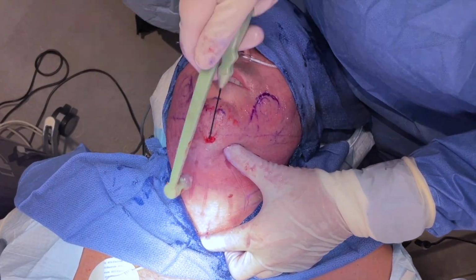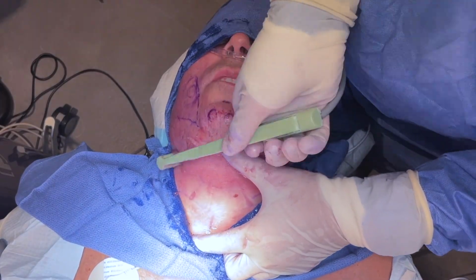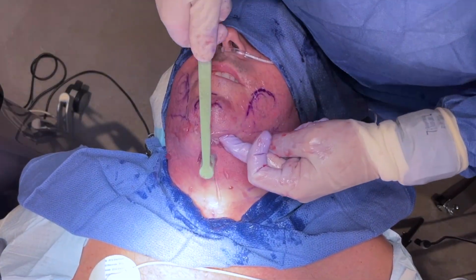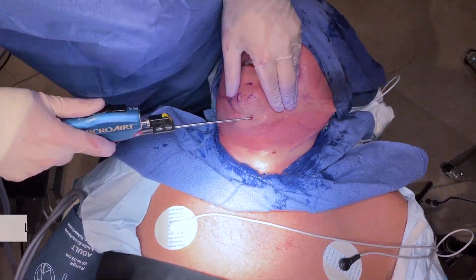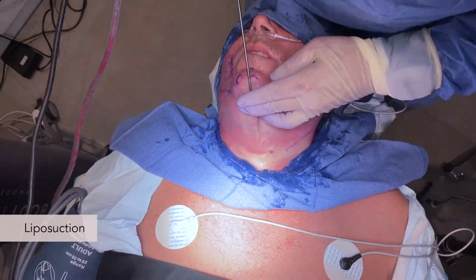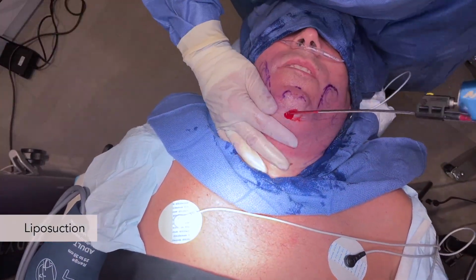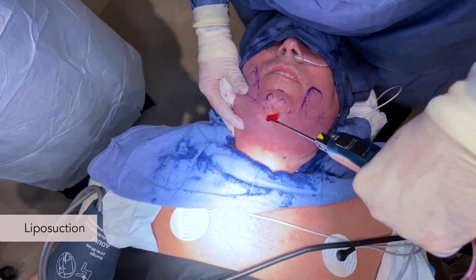Occasionally, in order to get to the energy levels that we desire, we may have to go back and retreat some of the areas. Once those temperatures have been reached and our energy has been satisfied, we're going to turn our focus to liposuction. Here I'm using a 2.4 millimeter cannula. The highest I usually go in the neck is probably about 3. I use the triport cannula. Start with the midline, then go and treat the side.